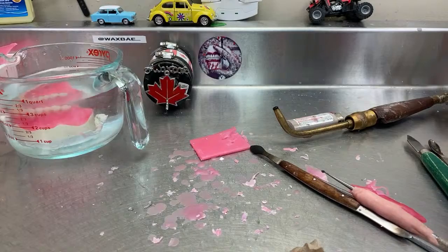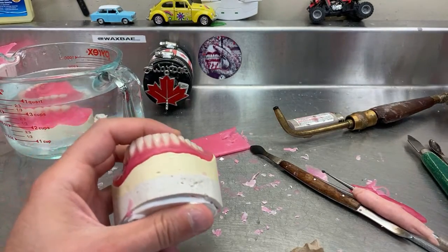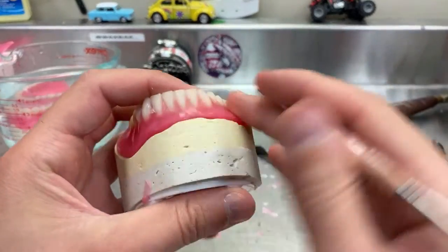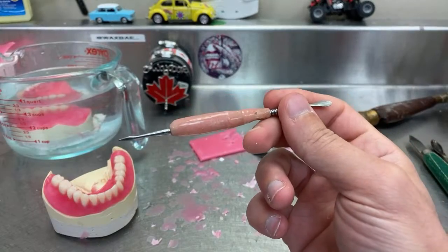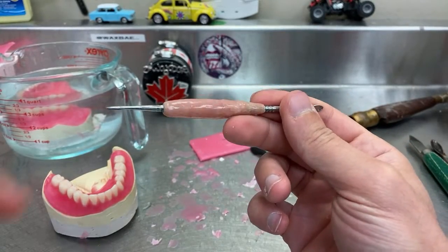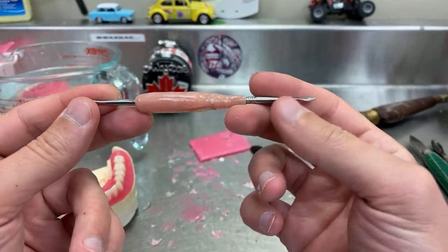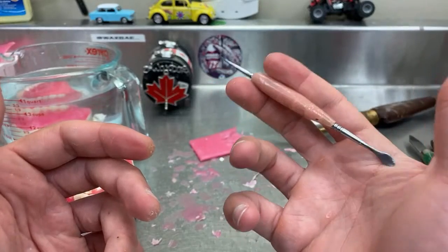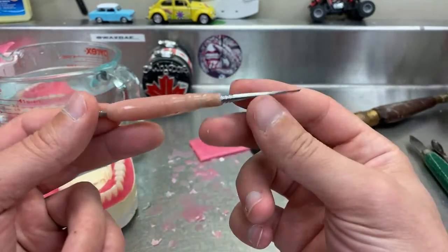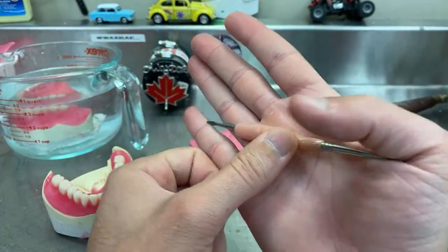Alright, I hate sitting down, so I'm gonna be working on this. Alright, another tool here that I use. It's for carving the necks. And same thing, acrylic here for a better grip. I don't use this for too long, so it's okay to hurt yourself a little bit, but it's very small.